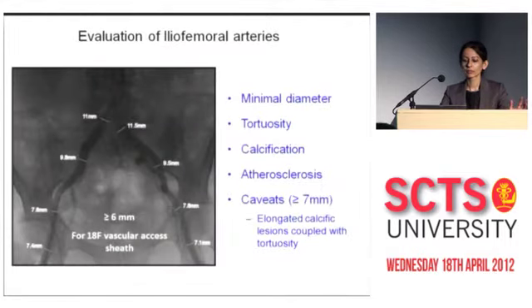So from the transfemoral perspective, there's no doubt, given the high complication rates, that the higher level of imaging and modality that you use, the lower your complication rates. We want to get as much information as possible, but the standard first basic assessment in these patients is angiography, and all patients will undergo distal abdominal aortography and iliac runoff. And it's good at giving a basic assessment of the peripheral vasculature, gives us an idea of the lumen size, but it's not great when looking for more detailed information in terms of disease burden, calcification.